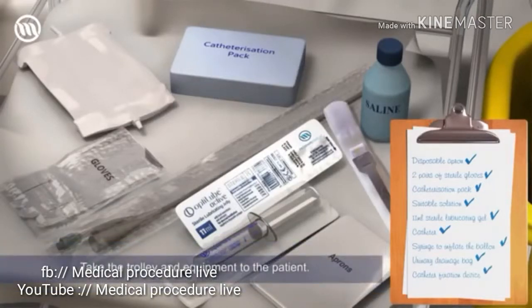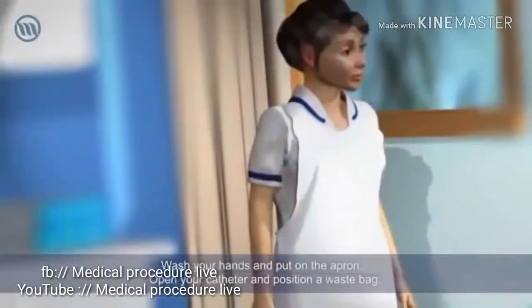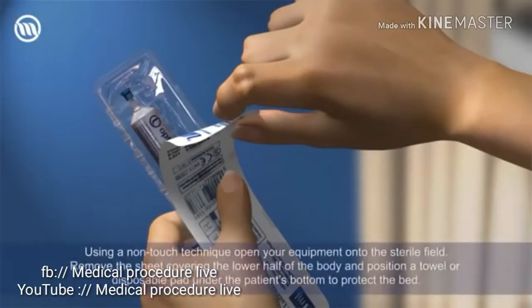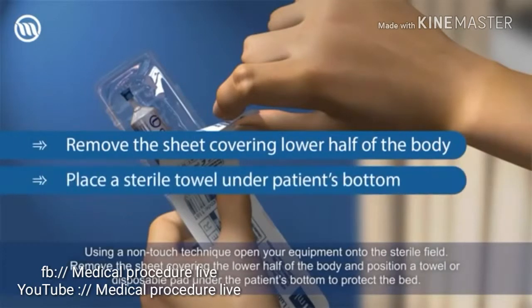Take the trolley and equipment to the patient. Wash your hands and put on the apron. Open your catheter pack and position a waste bag. Using a non-touch technique, open your equipment onto the sterile field. Remove the sheet covering the lower half of the body and position a towel or disposable pad under the patient's bottom to protect the bed.